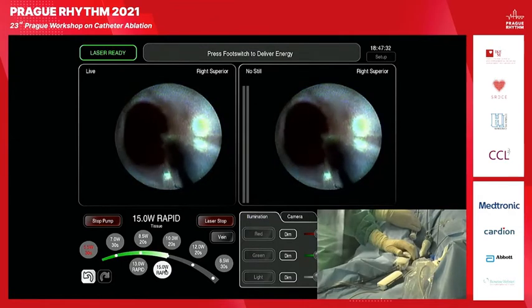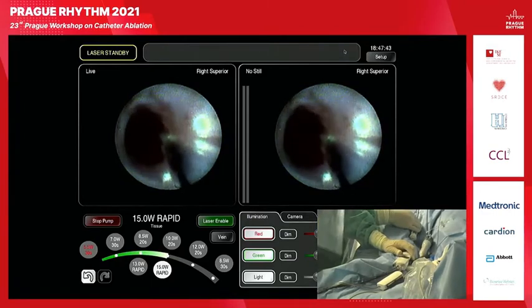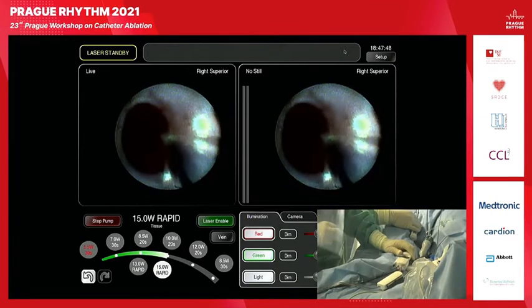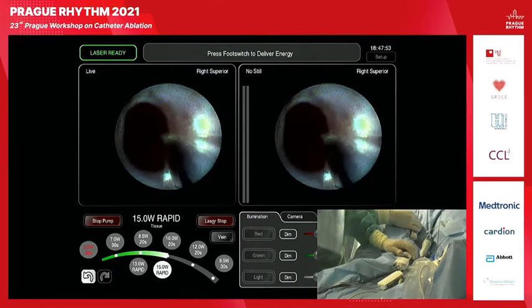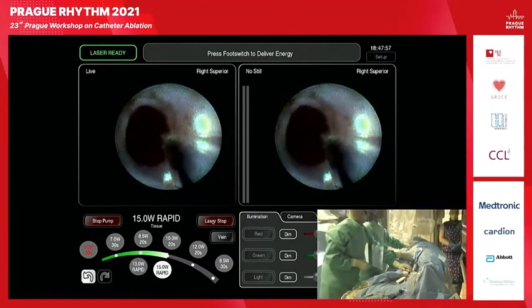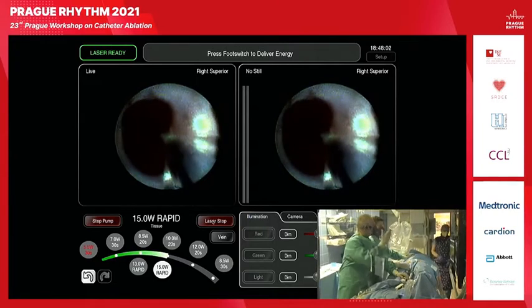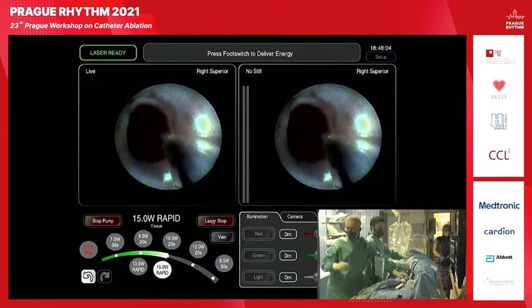You also comment on esophageal position, or actually esophageal monitoring? For all, I did already. And I can repeat it: for all patients we do for laser balloon ablation, every single patient, we have a temperature monitor in the esophagus, and it's in AP position, so it's actually a very neutral position, like the center position of the esophagus. So we didn't heat on the left side, and actually we are happy because we probably couldn't heat even from the right side. So let's go.